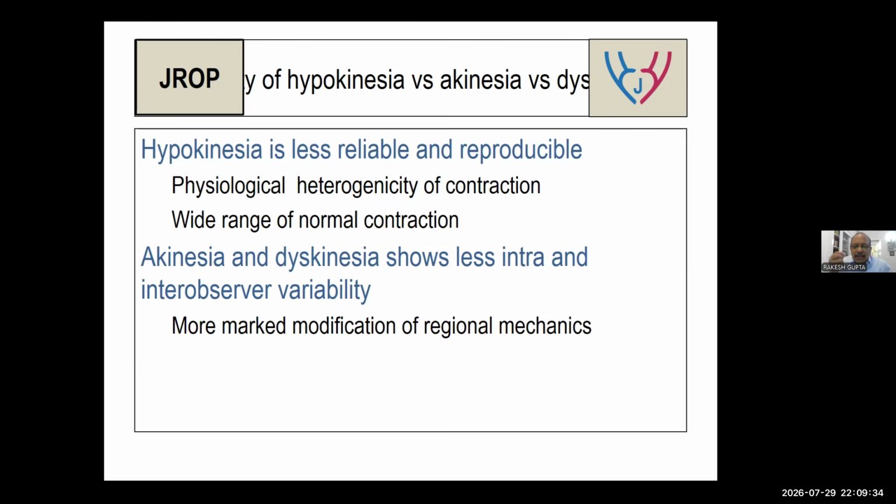So what will happen? You will find, in the four-chamber view, mid and apical septum, mid and apical lateral wall. Mid septum is supplied by RCA, apical septum is supplied by LAD. Apical lateral wall is supplied by LAD, mid lateral wall is supplied by circumflex. Now rotate: mid and apical inferior wall, anterior wall, mid and apical inferior wall. So they do not correspond to coronary disease territories. Yes, so that's how it differs. It will not follow the pattern.